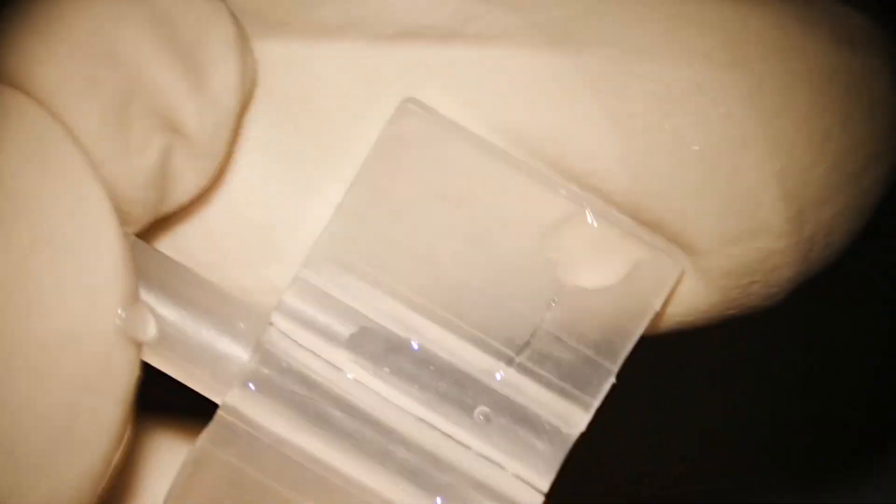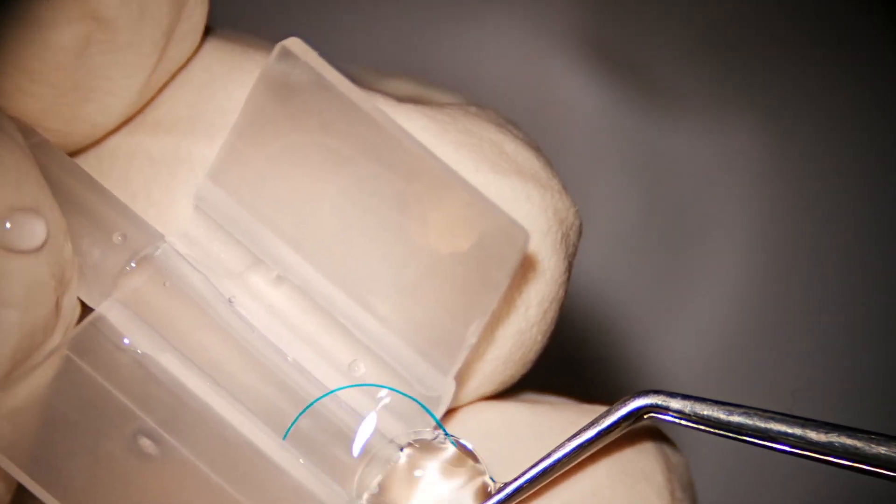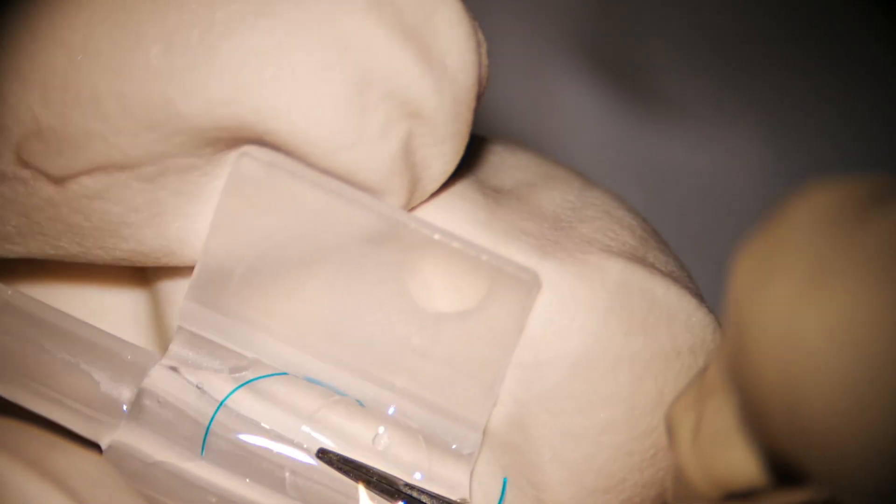Now we are going to load this lens. There is some viscoelastic in the cartridge, so place the lens here and just push it up to the mark. Now trace at the center of the lens.